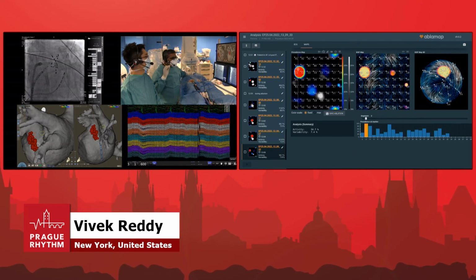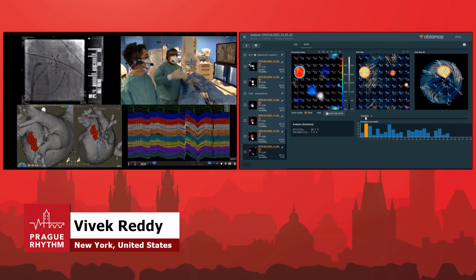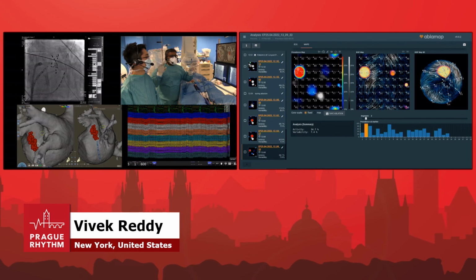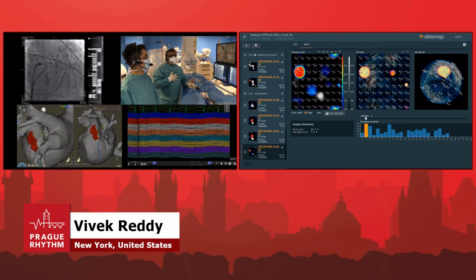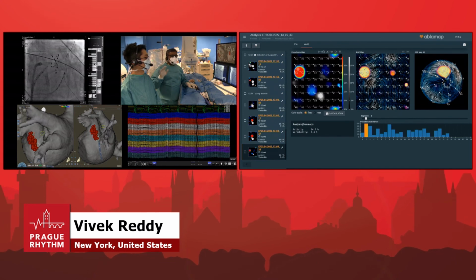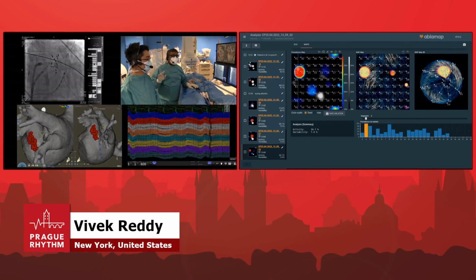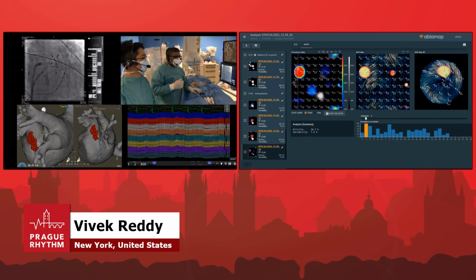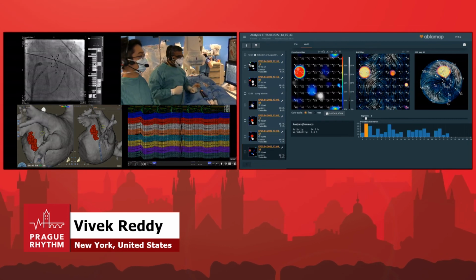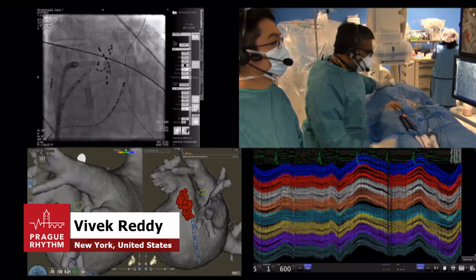But I just want to be really clear. In the big picture, if the ultimate procedure is to isolate the veins to get rid of triggers and ablate the 1 or 2 potential sources, in my mind, that's still a much more preferred procedure than something where we wipe out half the atrium completely empirically. So that's the vision that we're trying to get to. So I just wanted to make that comment. But thanks again for persevering with us. We'll let you know what happens in the next session.